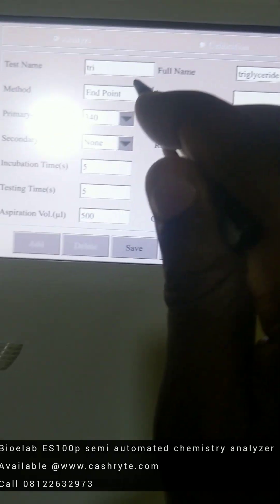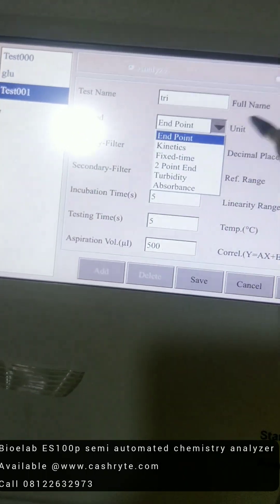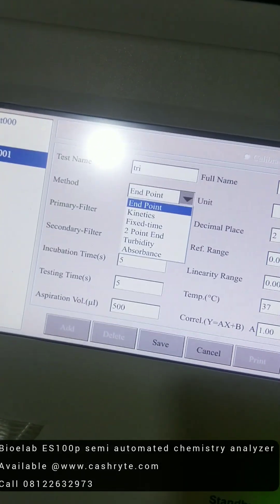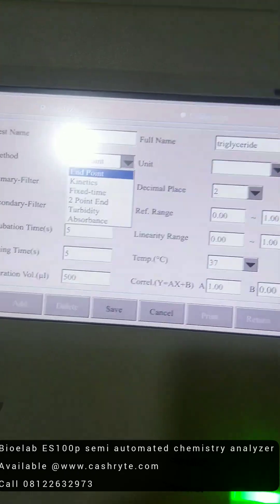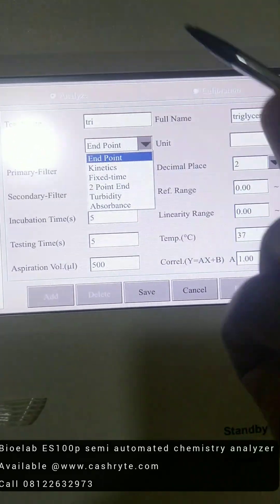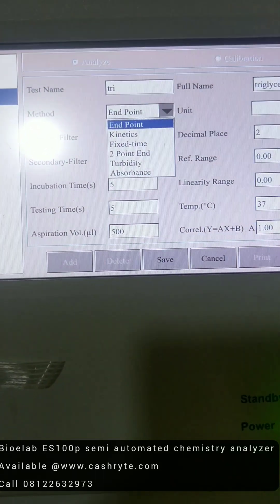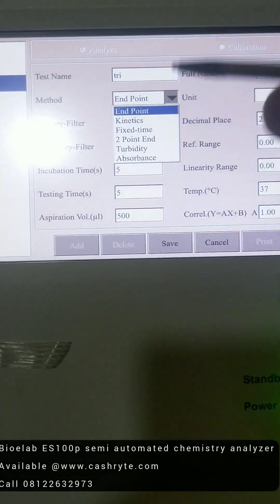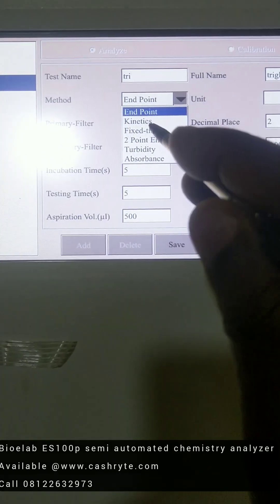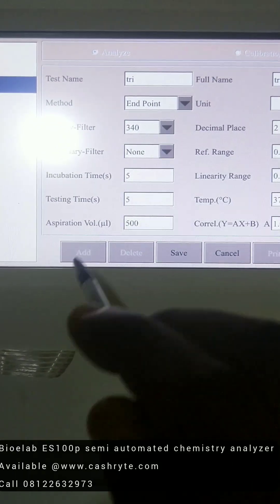So you set your endpoint. Depending on what the instruction is on the reagent, let's set it on endpoint or kinetic or fixed time to point. So it depends. So let's take for example, we're using endpoint.